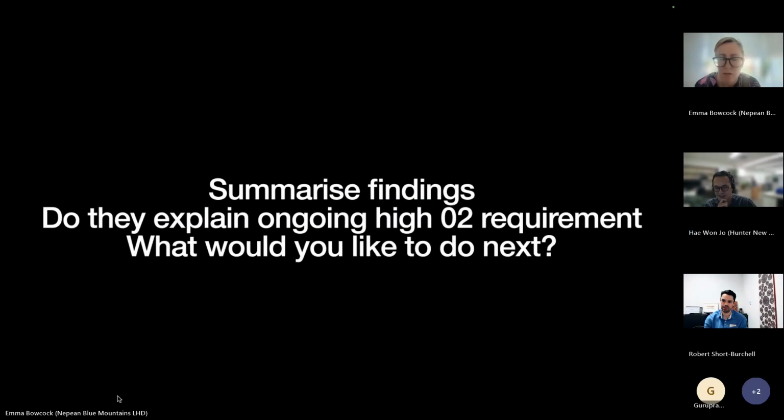Gosh, I realized that in the last 5 minutes, instead of synthesizing things, I just talked about what I saw on the images. Yeah, no, this is a complex case. I think you've done very well here, Juan. But try and have a little bit of structure for summarizing the key points, in the clinical context.